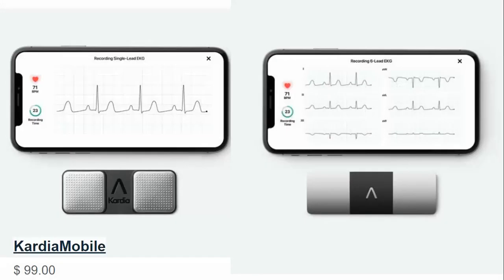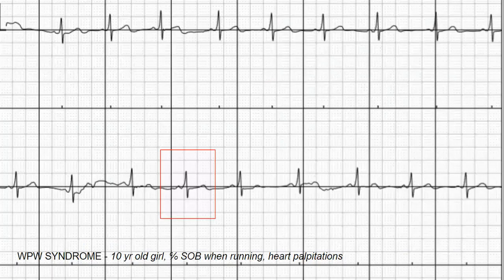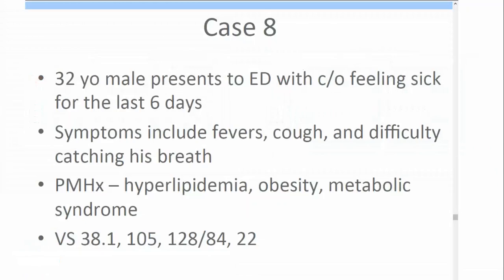Amazing technology that we have today. And it's almost, I mean, I toy with the idea of getting one of these myself, but I just wanted to show you the technology a little bit and how it plays out sometimes, but also just get appreciation for WPW in kids and adults and the association between atrial fibrillation and SVT. She had a lot of SVT in her presentation.